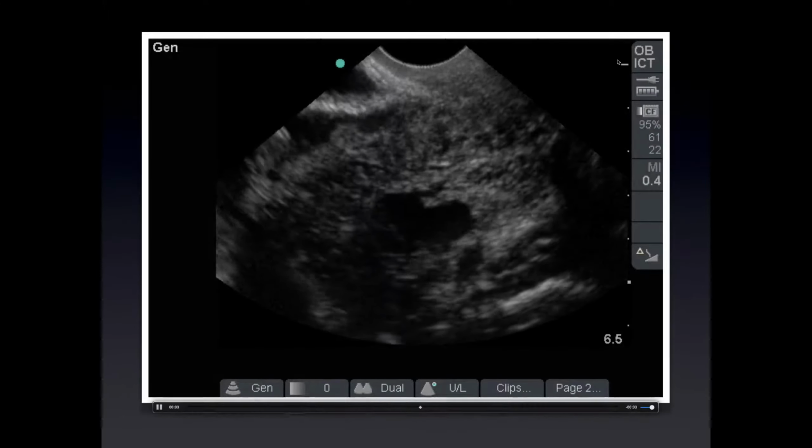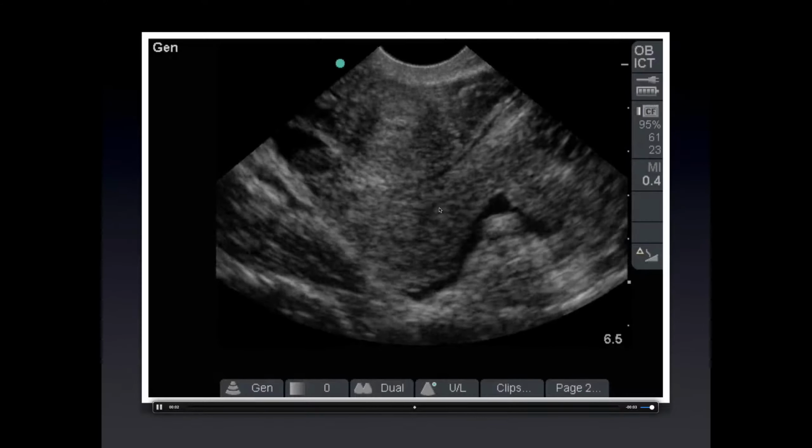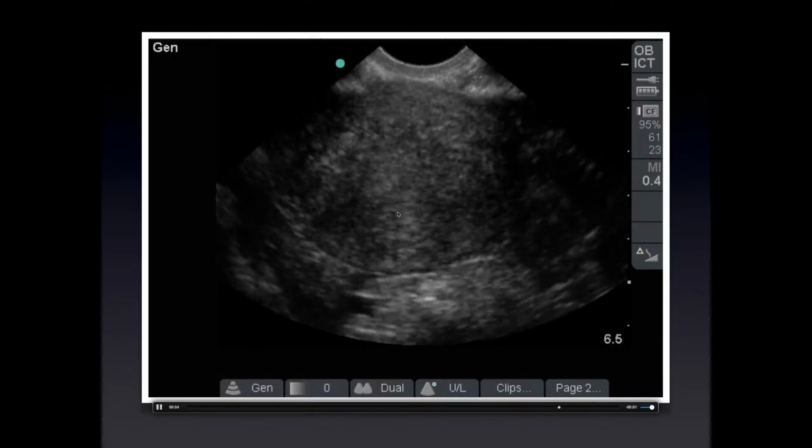We're doing our sweep through the uterus here, cervix there, so we know for sure that this is the uterus. See the endometrial stripe there. There's nothing inside of the uterus. Looking outside the uterus, there appears to be some free fluid, free floating between bowel loops. So I would therefore classify that as large free fluid. Same thing in coronal plane. Scanning through the uterus here, we're not seeing anything within it. We're seeing some large free fluid. Anything else catch your eye?